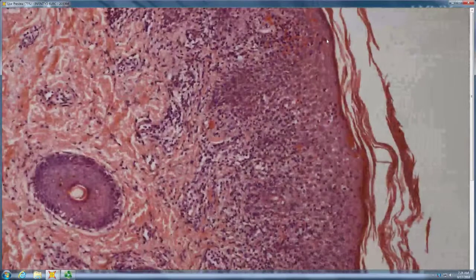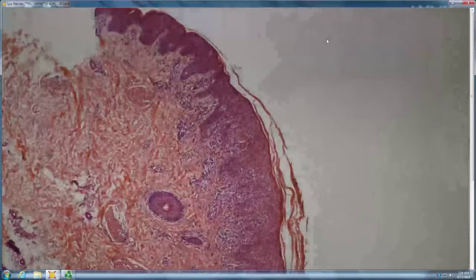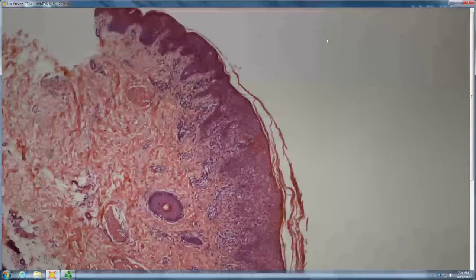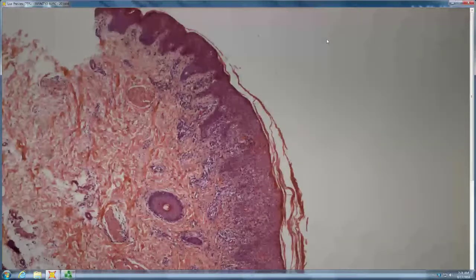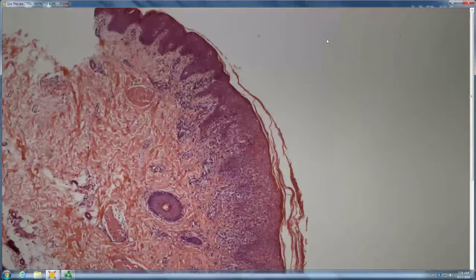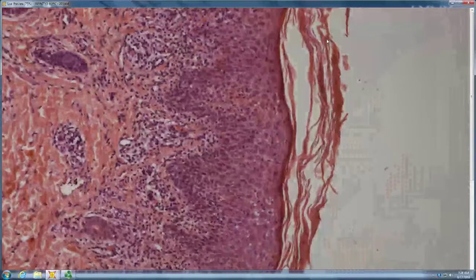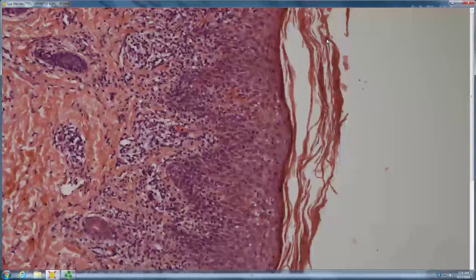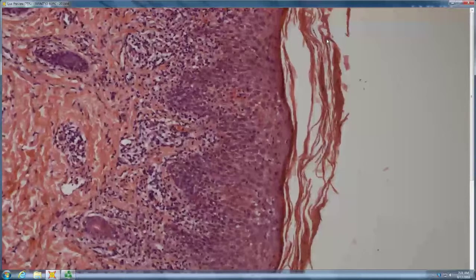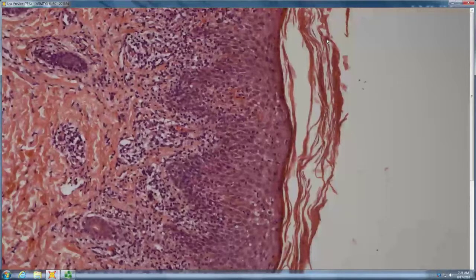Now remember, we can jump into any chapter, right? Because at your stage of training, you know all. So at the DEJ, it looks like there's an infiltrate. It almost looks sawtoothy. I'll accept that some of them are a little skinny. In general, though, are they rounded or are they pointed? I agree with you that they're more rounded. And you phrased that in the form of a question, so for Jeopardy, you were great.